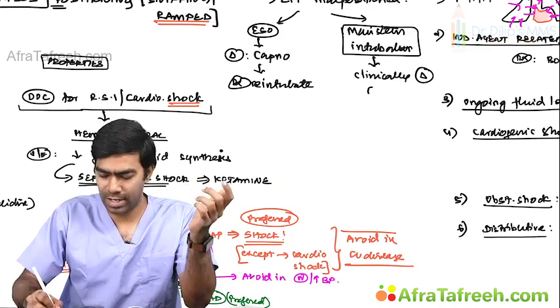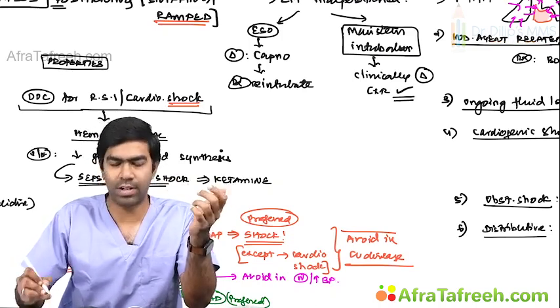So chest X-ray is the definitive one. Chest X-ray is the best and definitive one for confirming mainstem intubation after you confirmed with capnography. Remember, first of all, you have to confirm the placement in the trachea and in the respiratory tract using capnography. Then the depth can be assessed with the help of chest X-ray. Straight away, chest X-ray cannot differentiate between esophageal versus tracheal intubation, so it should not be used as a primary investigation. But for confirming the depth of the endotracheal tube, after confirming the placement in the trachea, your chest X-ray is the best. Okay. But clinically, you have to assess because the patient is going to rapidly desaturate.